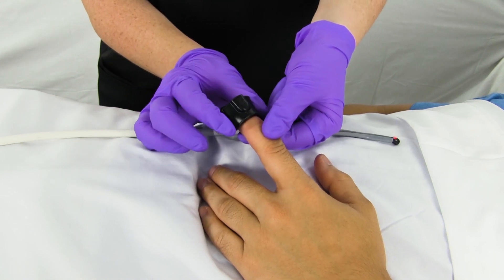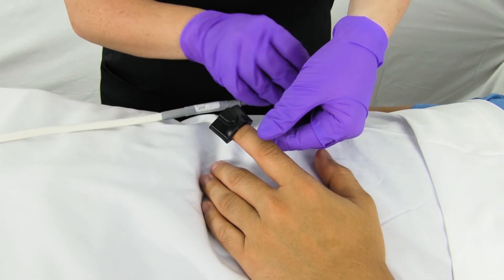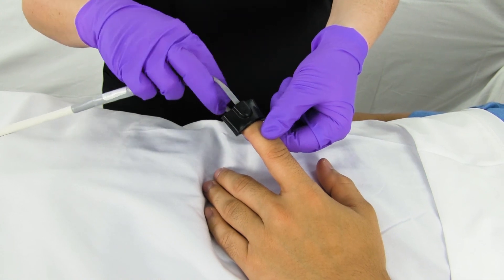When applying the reusable grips, slide the sensor over the selected digit and position the number icon so it is directly over the patient's nail bed.